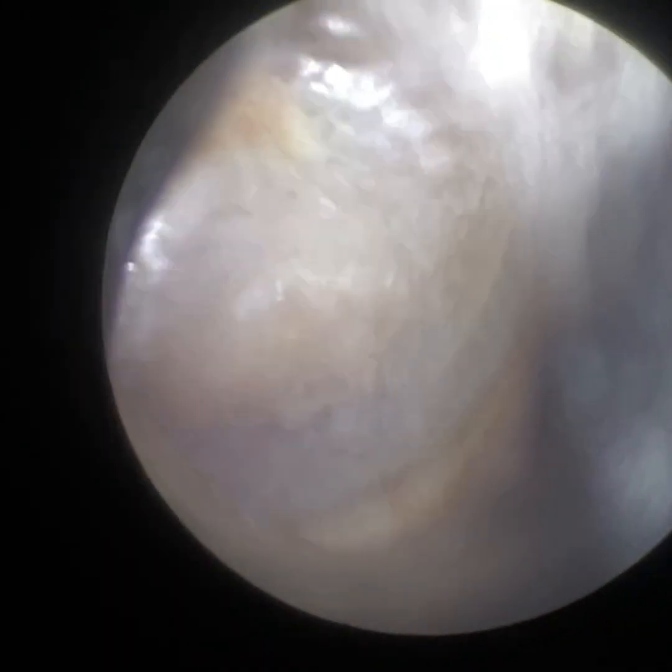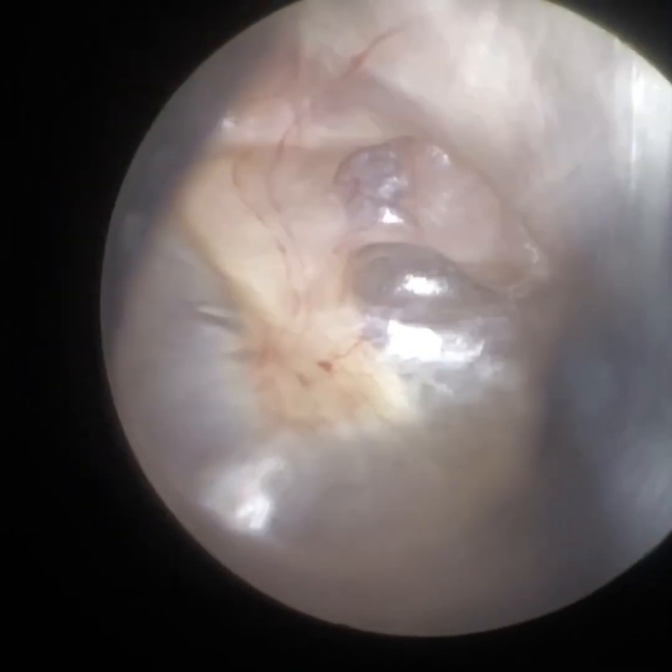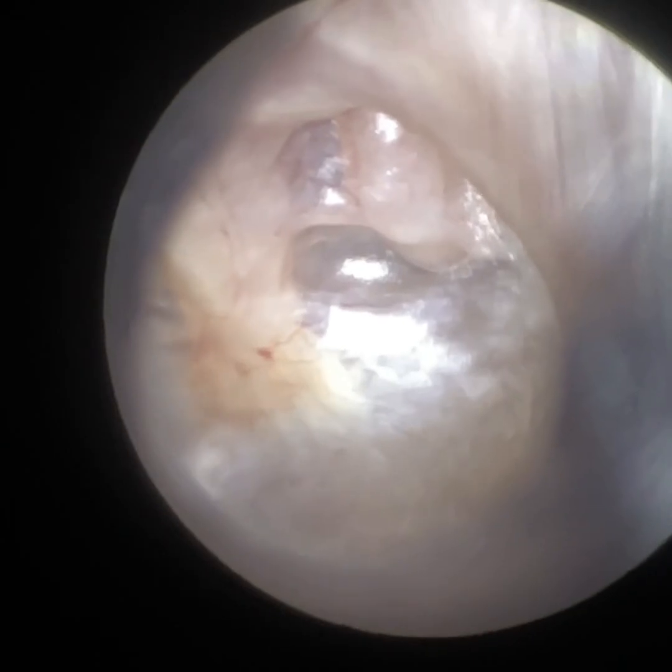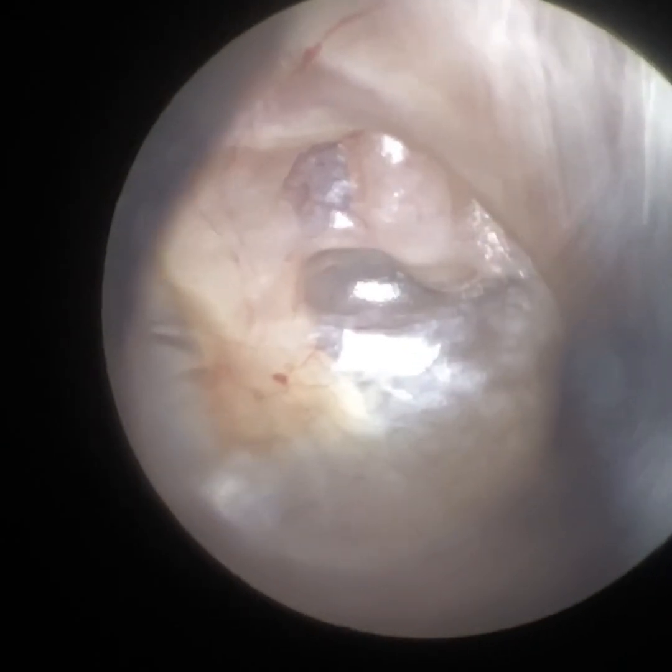So again, I'm just going to go back in, just getting the view again, and you can see it's extremely clear — that retraction — and the level of detail is great with the WaxScape.